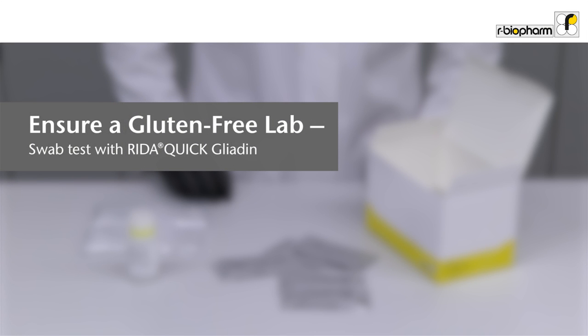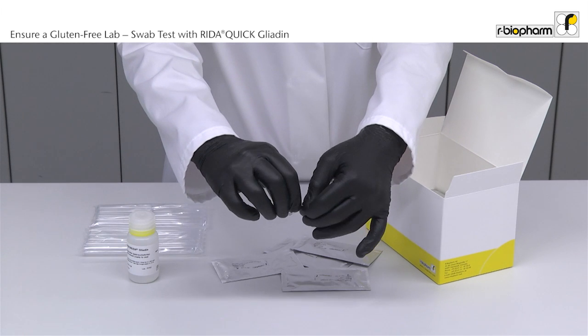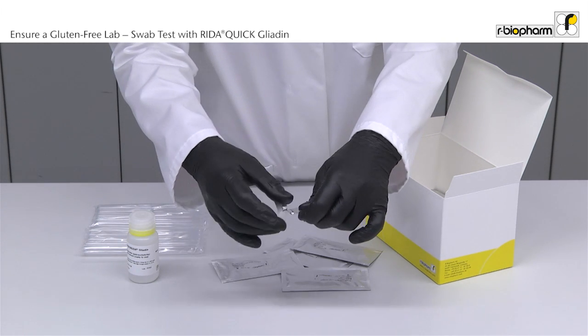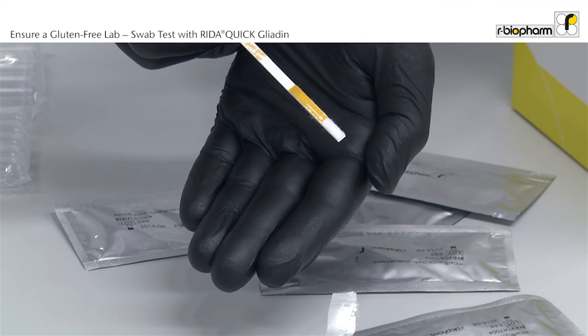Ensure a gluten-free lab. Swab test with RIDA Quick Gliadin. A clean lab is a prerequisite for a reliable gluten analysis of food. The immunochromatographic dipsticks contained in the test kit RIDA Quick Gliadin are single-packaged. The dipsticks are easy to use and ideal to swab surfaces.